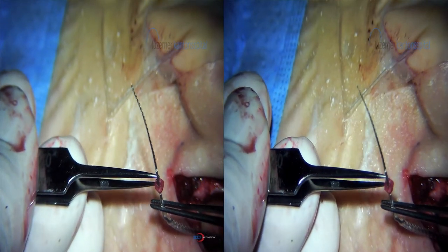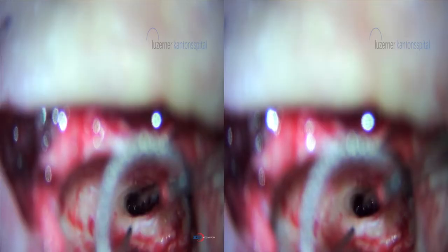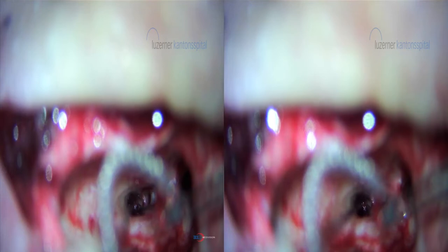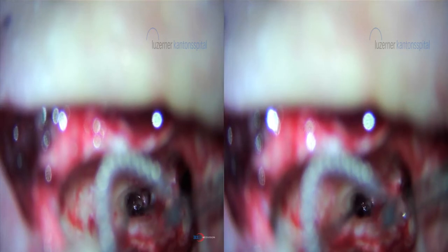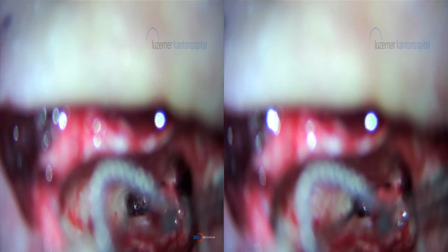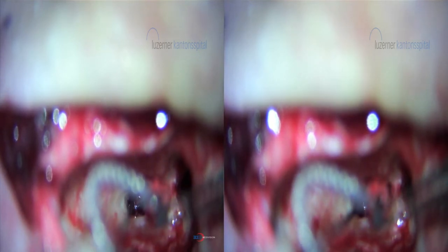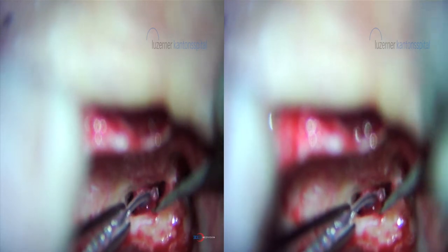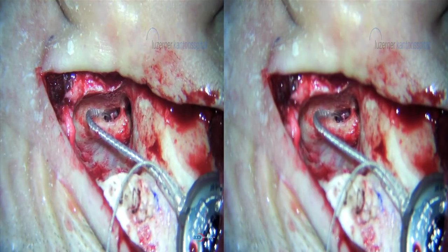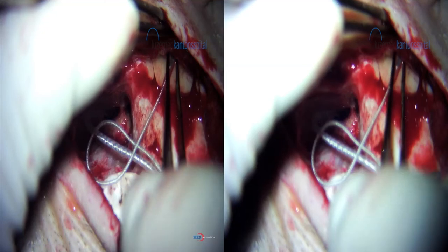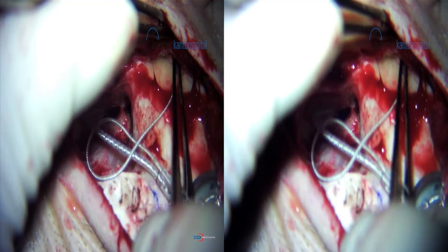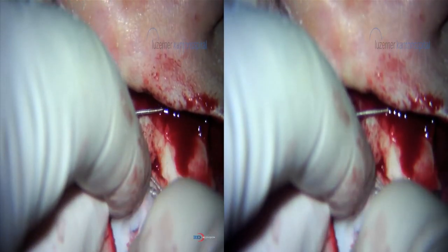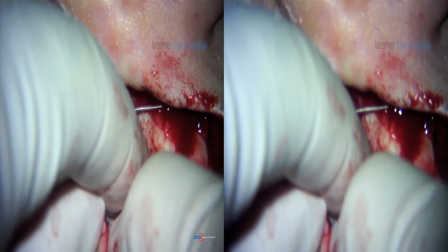We place a small periosteal piece with a hole over the electrode cable and gently insert a straight electrode into the round window. What was not seen is the puncturing of the membrane with a small needle; the periosteal piece has sealed the round window area.